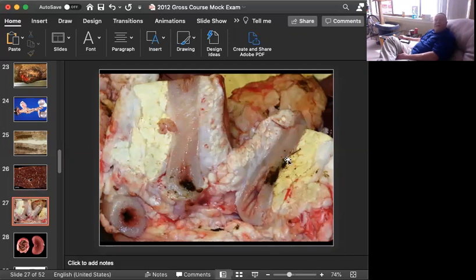Okay, so a couple of things I wanted to mention. Fat is not normally yellow in cattle. There are a couple of breeds like Jerseys and Guernseys, the Channel Island breeds, who metabolize vitamin A a little bit differently, and their fat is yellow. But normally, in every animal species, it should be white. It only becomes yellow when it's oxidized, when it's partially broken down, and it turns a yellow color. So this yellow color is very abnormal.